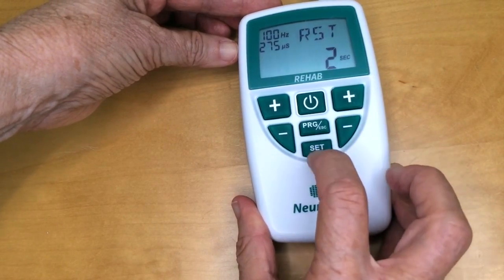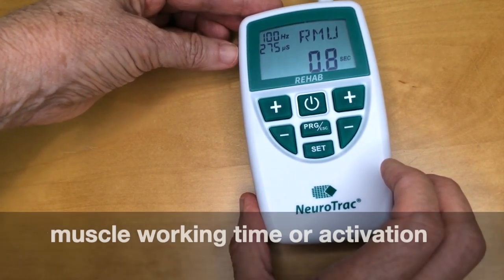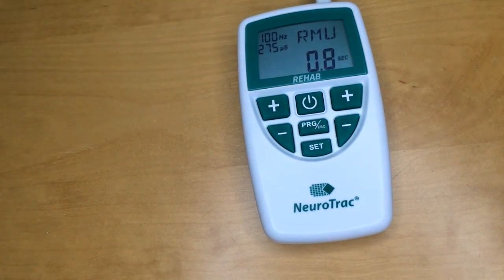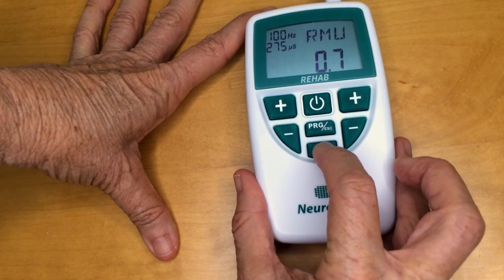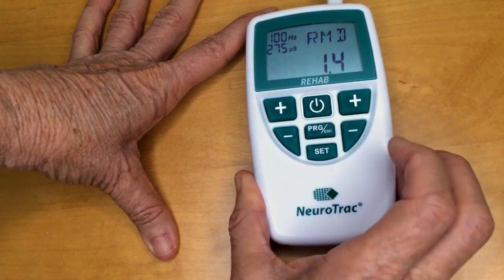Press set again and this is ramp up — the slow or ramped increase of stimulation up to the muscle working time or activation. If you didn't have the ramp up time, the muscle activation would suddenly be on at full amplitude, or suddenly off in the case of ramp down. Use the plus and minus buttons to move up or down, then set will bring you to ramp down, where again you use the side buttons to determine how long you want that to be.